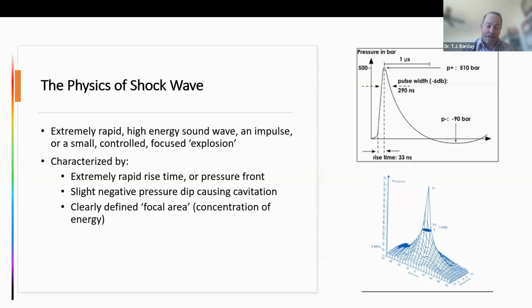There are other devices out there that produce so-called radial shockwaves, and those are really a different thing entirely. They're generally not true shockwaves, and really work differently. So we're not going to discuss those at all today.